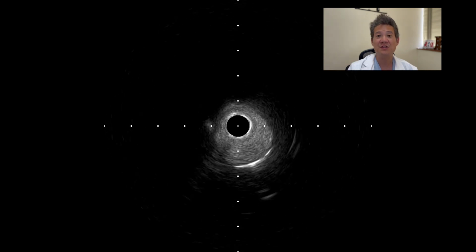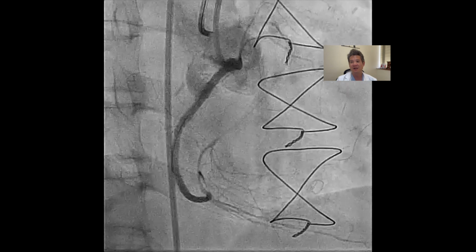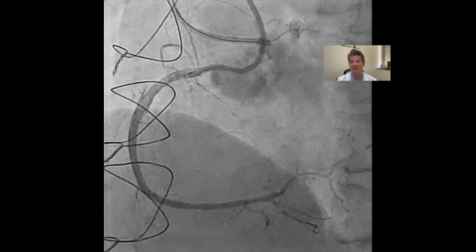So after this it is easy, I just ballooned and stented the vessel with a very nice angiographic result, and I completed the procedure in 3 hours and 25 minutes. The patient could still stay on table, and with a very nice angiographic result. So finally, this unfortunate man got total revascularization through a series of techniques.